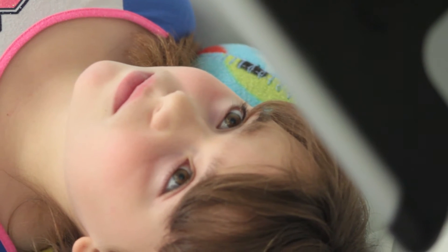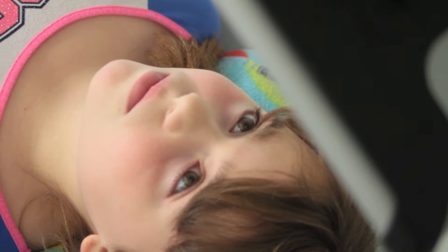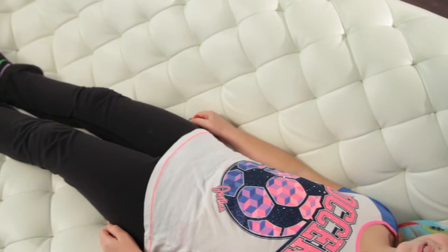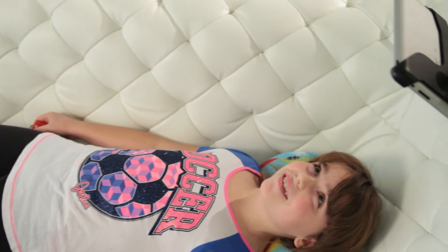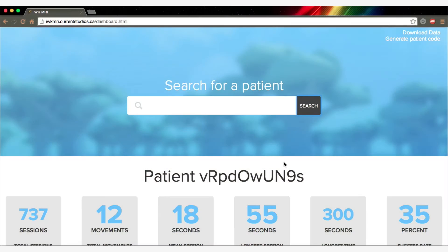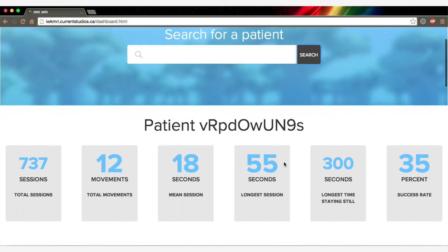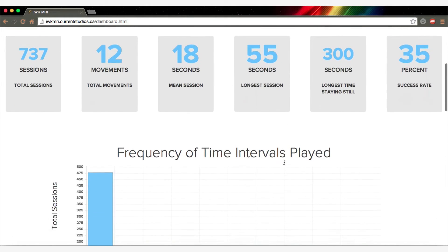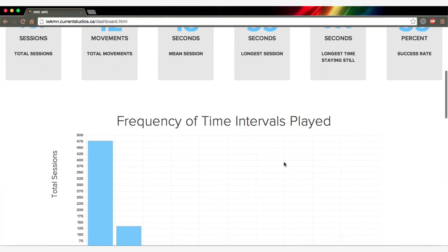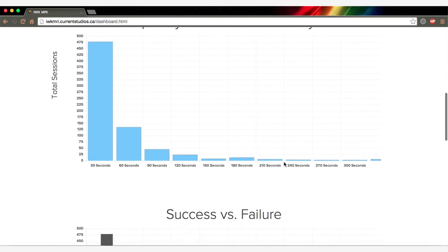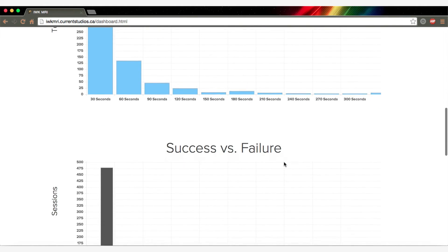This information is intended to reduce unnecessary general anesthetic, improve MRI efficiency, and to reduce the stress of the MRI experience on the child. The child's progress and gameplay statistics are tracked and displayed on an online dashboard, available for the physician and technicians to view and evaluate the need for general anesthetic.